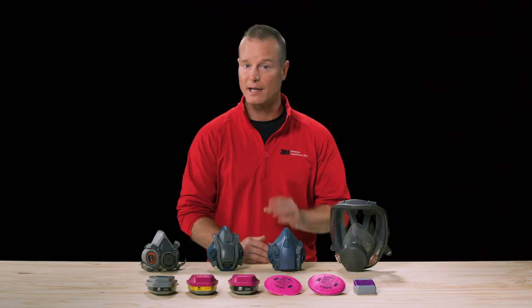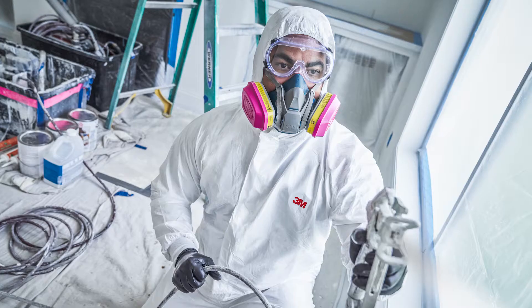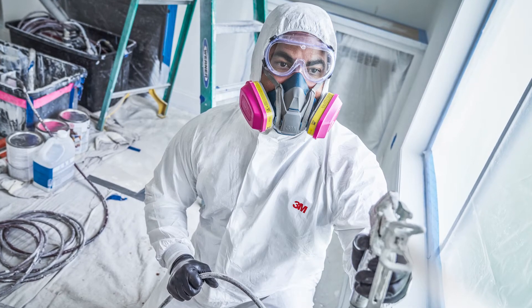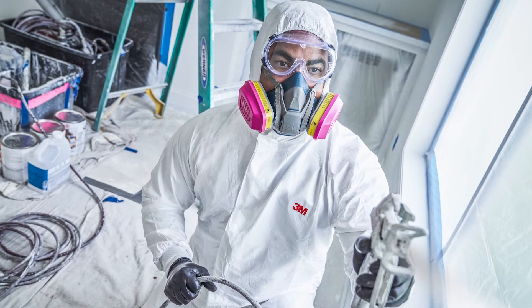Silicone, for example, can be softer than other materials, which some find more comfortable. This is important because a reusable respirator is often worn for extended periods of time.